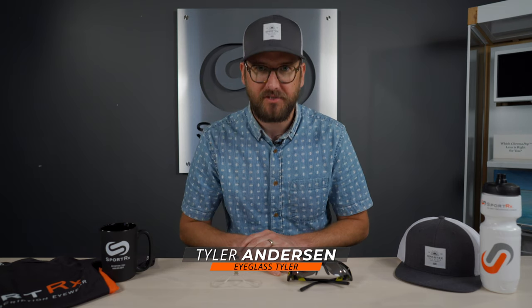Hello, I'm Tyler from SportRx. I'm an optician here and I want to talk to you about the Show X2 and the insert that goes into the Show X2 and how you mount it, because it's a little bit confusing — there are kind of some misconceptions out there.